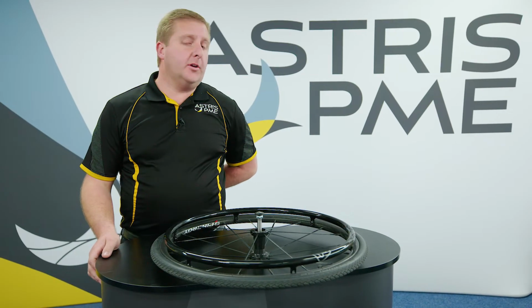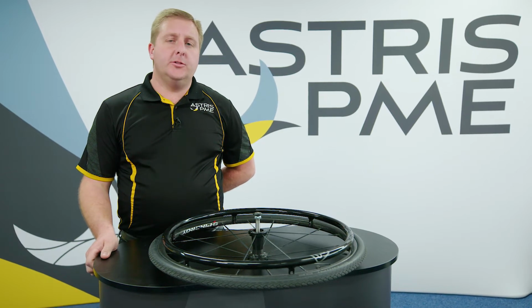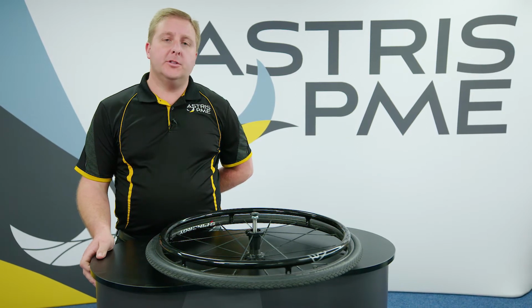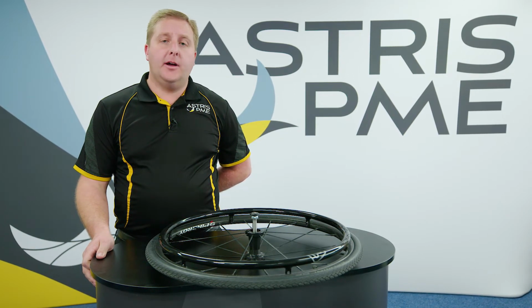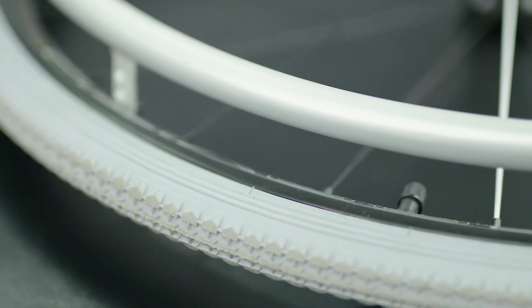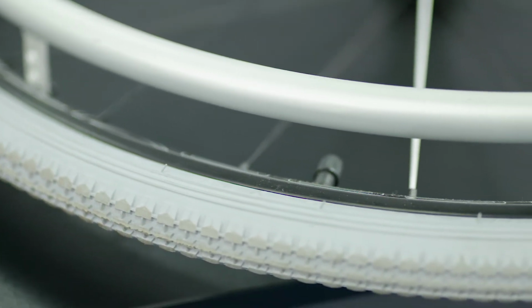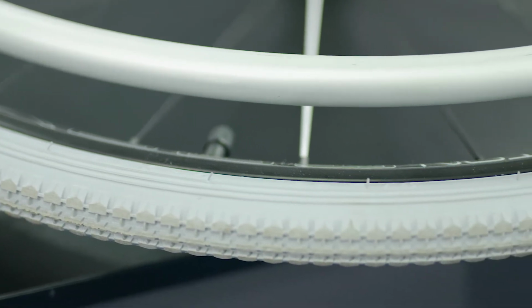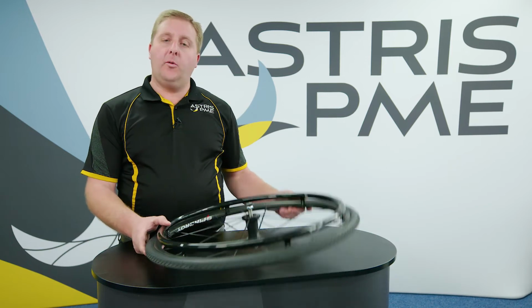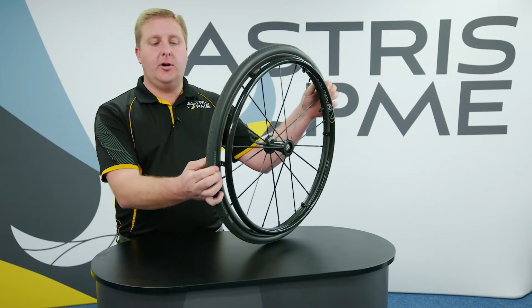A common question frequently asked by wheelchair users is whether I have a solid tyre on my wheelchair or a pneumatic tyre, which is a pump up. A pneumatic tyre is a tyre that's easier to push, 2 or 3 times easier than a solid tyre. However, a solid polyurethane tyre has no maintenance. There's no punctures and lasts longer, therefore easier to maintain. It is quite common for active users to have a lightweight wheel and a high pressure tyre, which has a higher pressure rating, so there's less friction on the ground and easier to push.